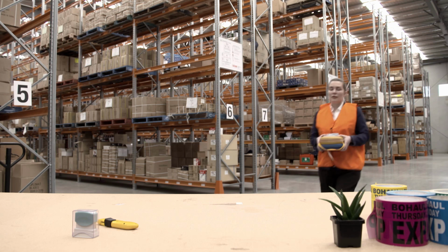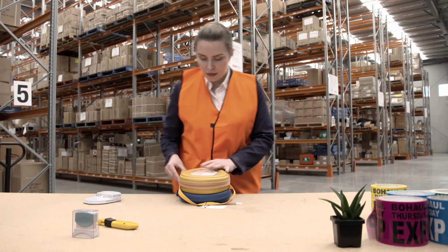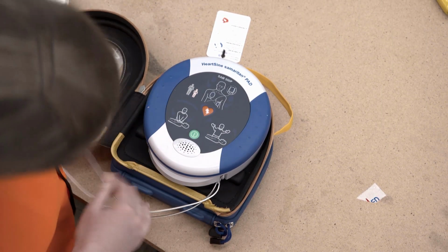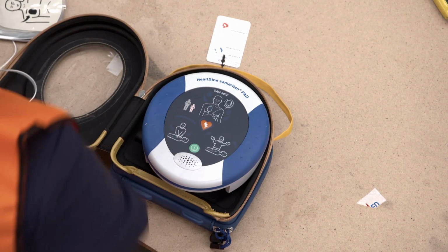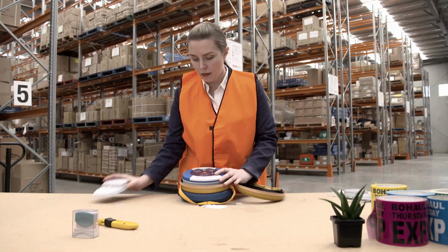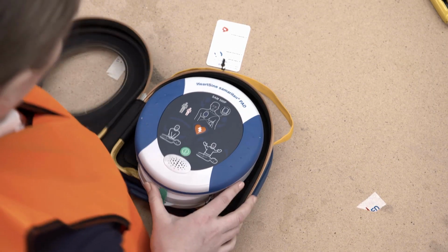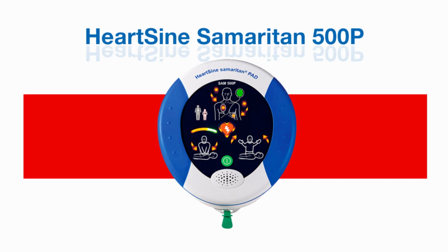After using the 500p, or after 4 years since purchase, you will need to replace the battery and pad pack. Press the 2 locking tabs on the side of the battery and pad pack and slide the pack out. Insert the new battery and pad pack into the 500p until the tabs lock into place. To ensure your defibrillator is working, once a month, simply check the light is flashing, and you can rest easy knowing your device is ready to go in an emergency.